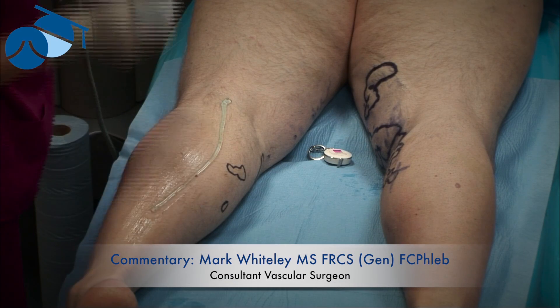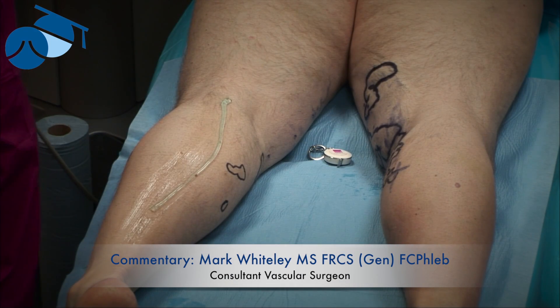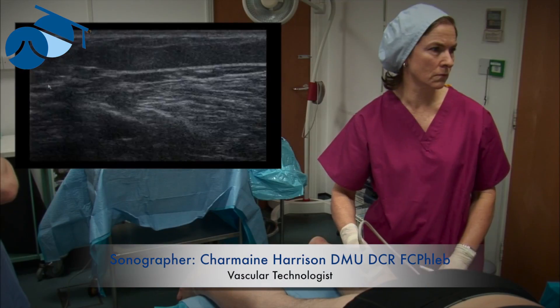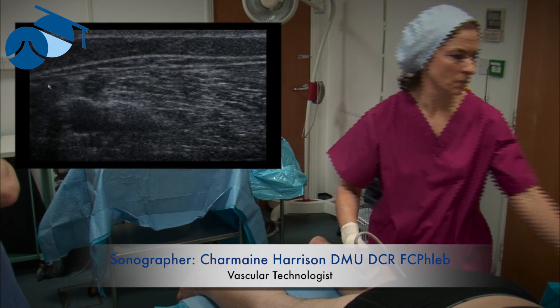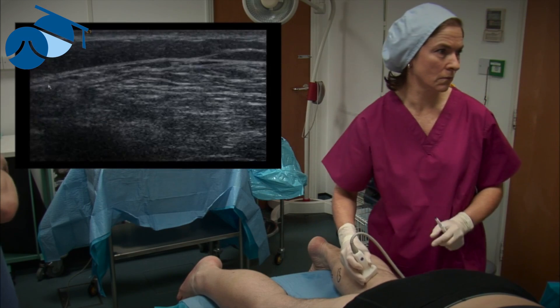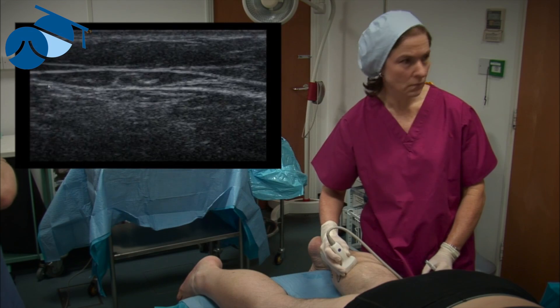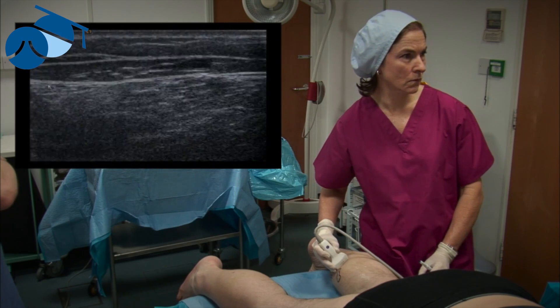We're now going to mark the small saphenous vein and one perforator coming off it that's incompetent. This is the way we would mark the small saphenous vein if we were going to treat it, but as you can see on the ultrasound, it's very very small, lying within its fascia just above the muscle.